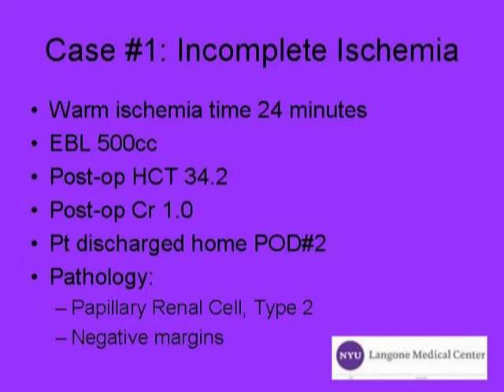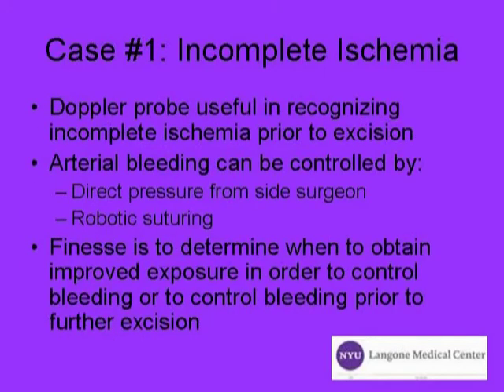The patient was discharged post-op day 2. This case demonstrates that the Doppler probe is useful in recognizing incomplete ischemia prior to excision. Arterial bleeding can be controlled by direct pressure from the side surgeon or robotic suturing. The key is to determine when to obtain improved exposure in order to control bleeding prior to further excision.